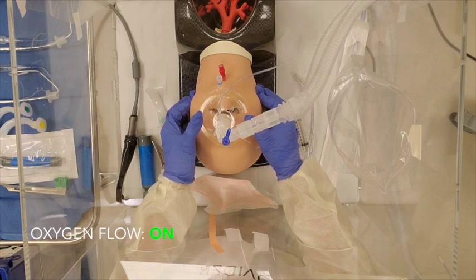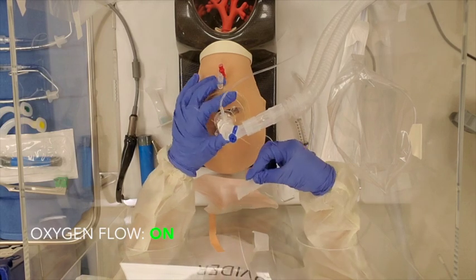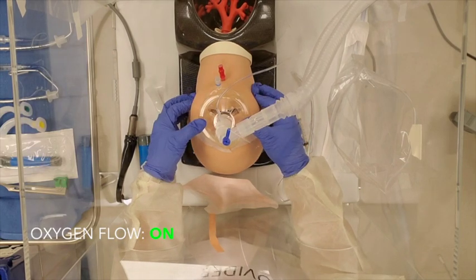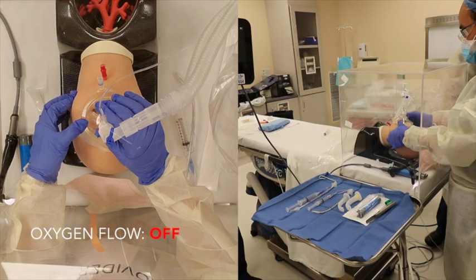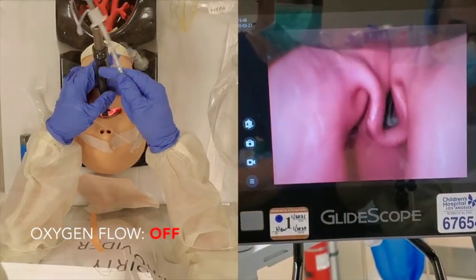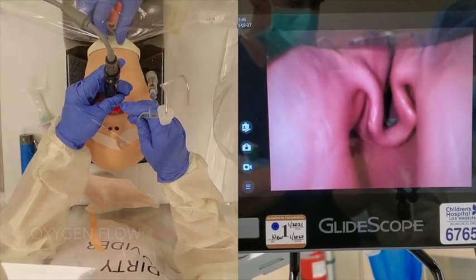The assistant then administers the induction medication. The operator applies eye tape and is careful not to remove the mask. Once the patient is adequately paralyzed, the assistant will turn off oxygen flows and the operator will use video laryngoscopy to intubate the patient. At any time during induction, if the patient has copious secretions or vomiting, the operator will suction the oral cavity and position appropriately to prevent aspiration.